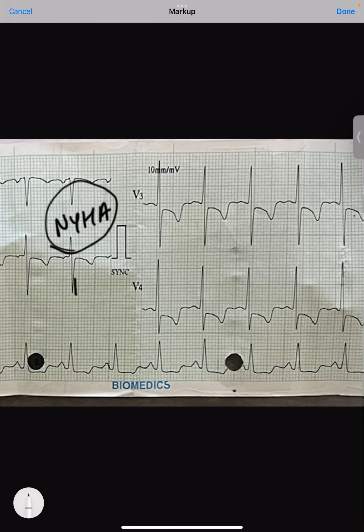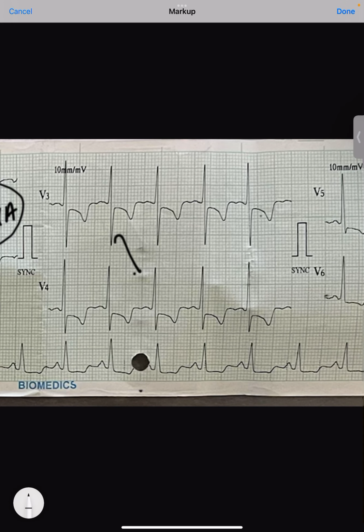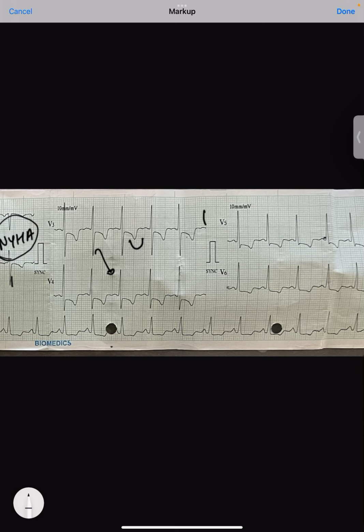So if a patient is presenting with a downsloping ST depression, T inversion, one of the most important things is it can definitely be NSTEMI if cardiac biomarkers are positive like troponin T, troponin I, or CPK-MB. Second, it can be very typical of a strain pattern.